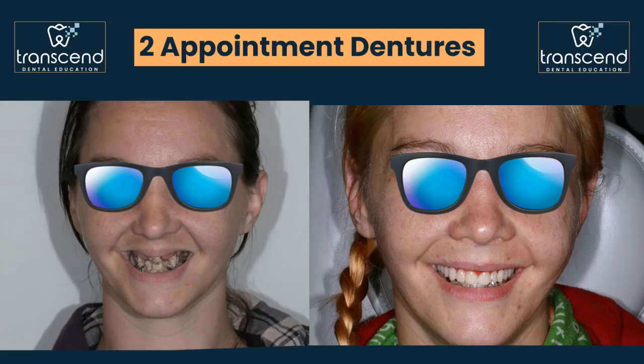There's no reason you couldn't maybe even do this in a single day, where the first time you see them is in the morning, and then you're giving them their dentures by after lunch. That is life-changing stuff to be able to do in a general dentist office. You've got complete control over the process. So if you need to hear a pitch for digital dentures, I don't think I need to say much more than the fact that you can consistently do complete dentures in 2 appointments where you knock it out of the park without needing try-ins and stuff.